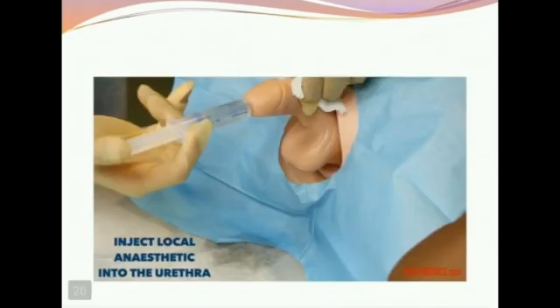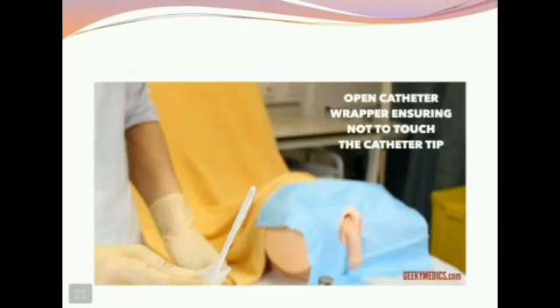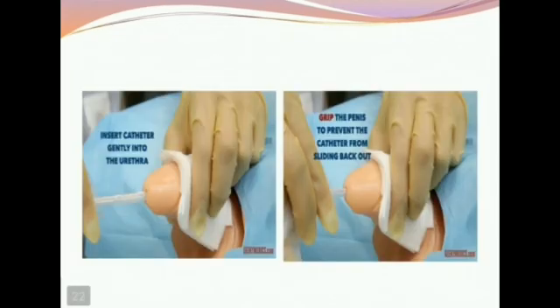Hold the penis vertically with non-dominant hand using sterile gauze and inject the anesthetic gel into the urinary meatus and continue to hold the penis in position to ensure the gel remains in urethra and allow 3 to 5 minutes so that it reach its maximum effect. Open catheter wrapper, ensuring not to touch the catheter tip. Inform patient while inserting catheter.